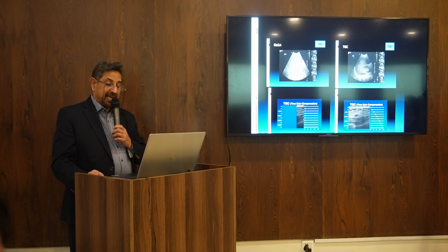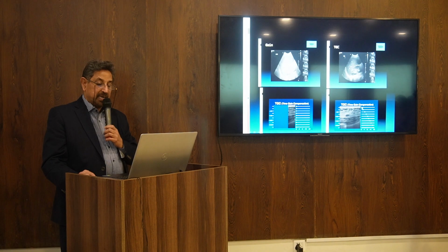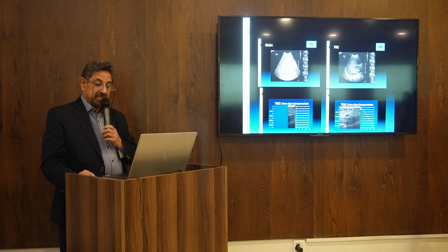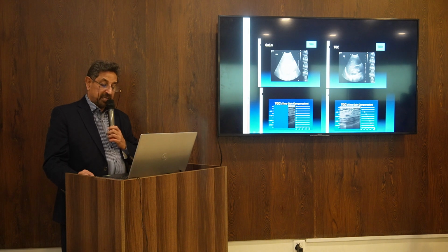To compensate, we always keep our TGC in such a manner that echoes coming from the nearest part of the body are compensated minimally, but those coming back from the farthest part get maximum compensation.